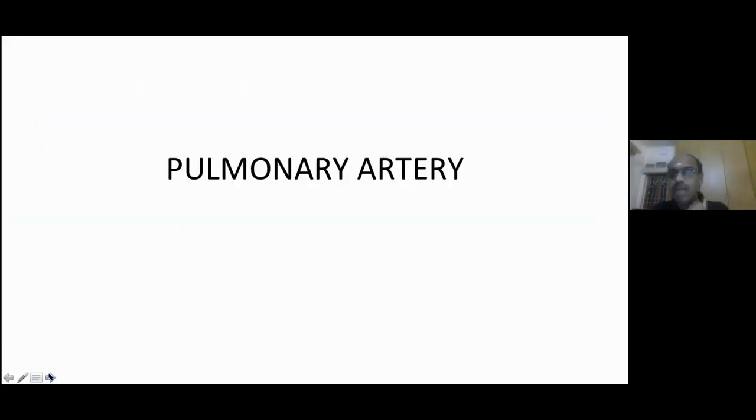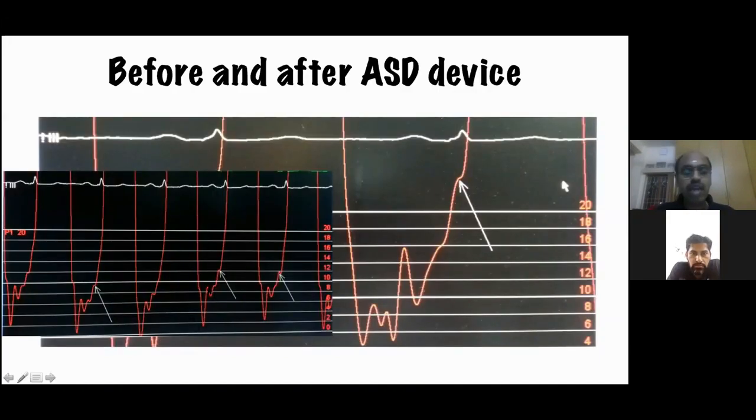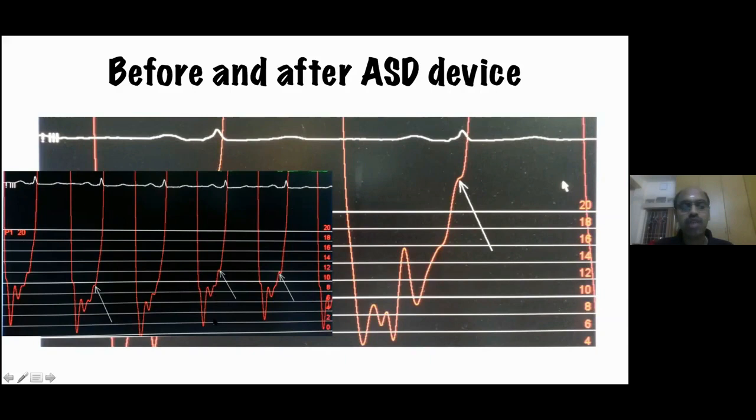We started with pulmonary artery. There is a question about what is a rapid filling wave. I'll just briefly go. Rapid filling wave is, in other words, some people will call it dip diastolic pressure. The sudden deflection of the left ventricular pressure going up to the baseline 0, sometimes in a partially underdamped tracing, it might go even less than 0. This particular wave is called the rapid filling wave, and this rapid filling wave is an index used sometimes in some types of diastolic heart failures. We will come to it when we are talking about restrictive physiologies.